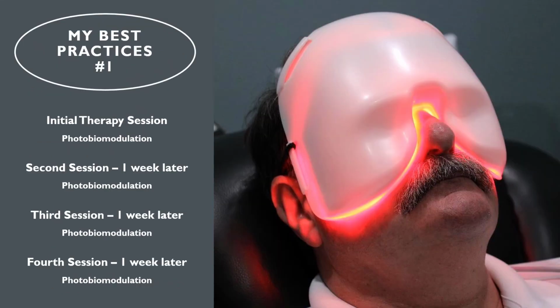Here's, he's now being treated. So we have the red mask on, and there are no set protocols for this technology right now. I don't think there will ever be, because everybody is different. You know, I don't want to say you're shooting from the hip or from the seat of your pants, but everybody's different, and you can devise two or three different treatment protocols or paradigms and end up with the same end result. That's what I've seen. So there's more than one way to skin a cat.